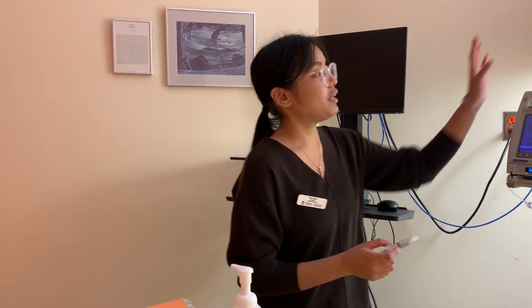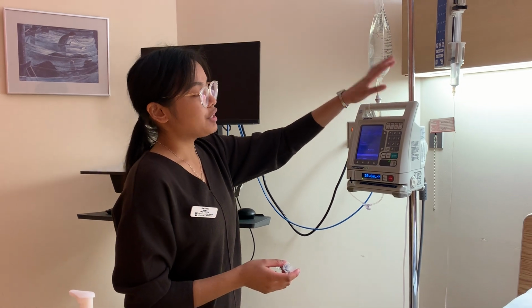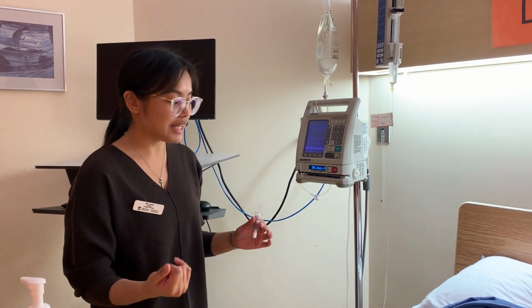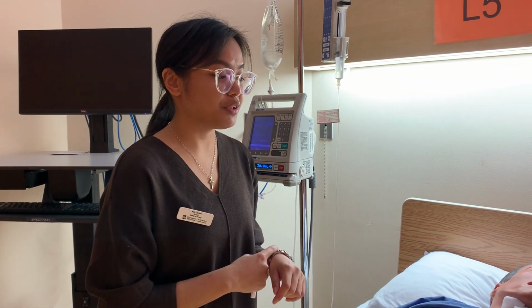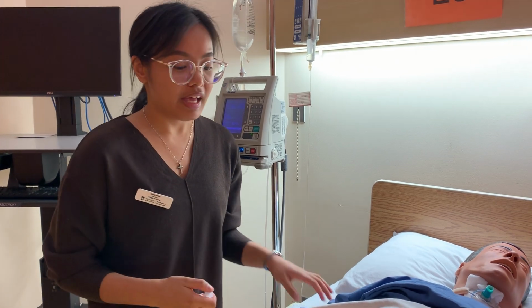And I do the same thing, put in the CIVA pump, press start, make sure it's running appropriately, there's no kinks, obstructions, the IV site looks good, doing a bedside safety check, making sure the bed is in lower position, the side rails are up, there's no clutter on the floor, the patient is not distressed. I'm letting the patient know about the side effects such as the hypersensitivity, allergic reactions, rash, and headache and nausea. So if you experience any of those, let us know, and that should be good.